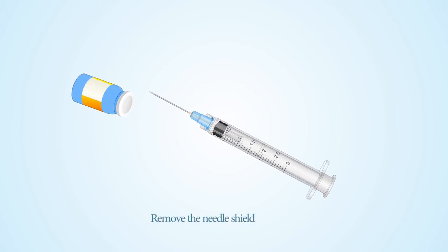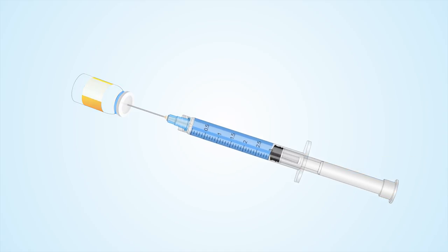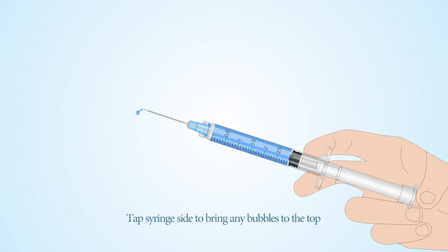Remove the needle shield. Tap the syringe side to bring any bubbles to the top. Expel any excess air.